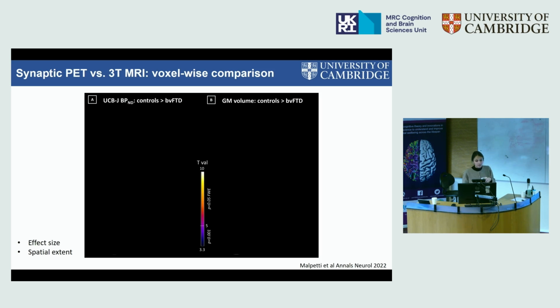So then, where is MRI in all this story? Basically, MRI is always our safety, like our safe friend. We use that in clinical practice to look at the different impairments in the brain, where the atrophy is localized. So when we identify a new marker, we always go back to MRI and try to understand what the new marker can bring in terms of added value.